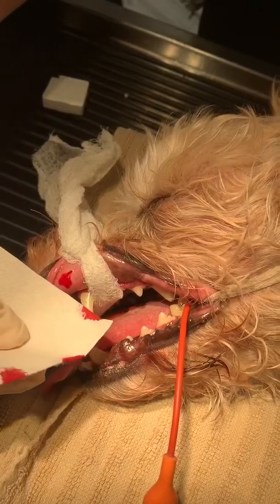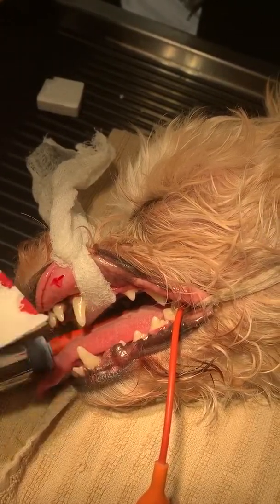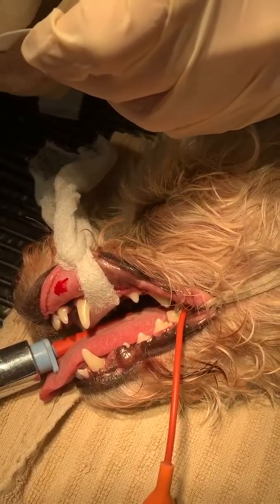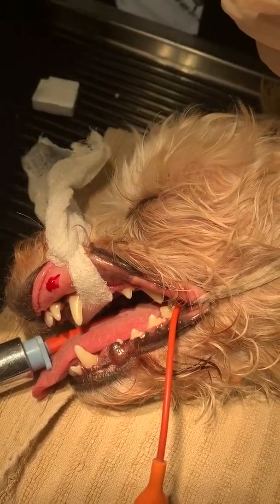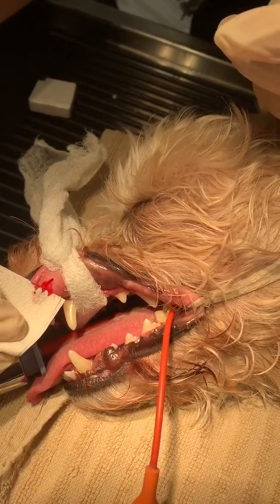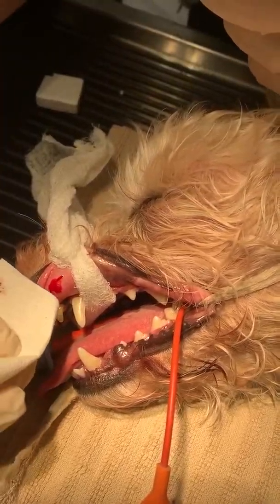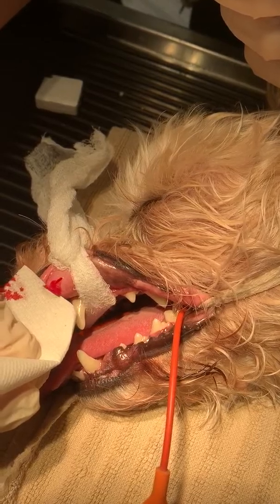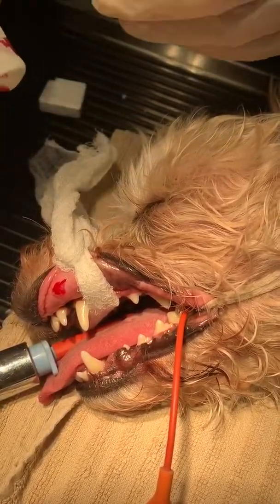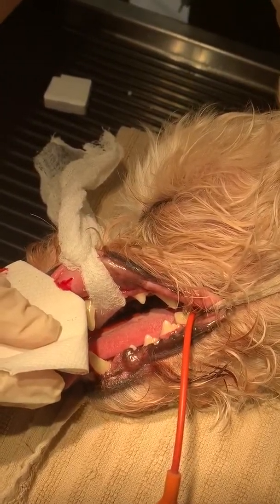This is testing the clotting factors that are going on. Now for dogs, it should be less than four minutes that it would stop bleeding. For cats, it would be less than three minutes. But I have the timer set for five just to give me a parameter, and I can subtract the time that passes from the five minutes to find out exactly how long it took for it to stop bleeding.